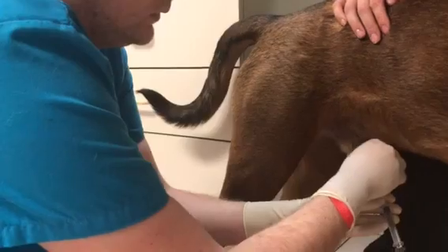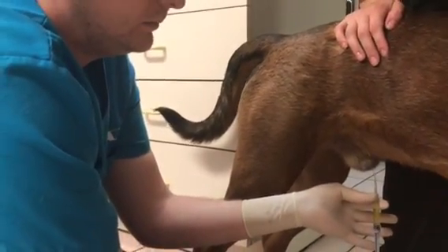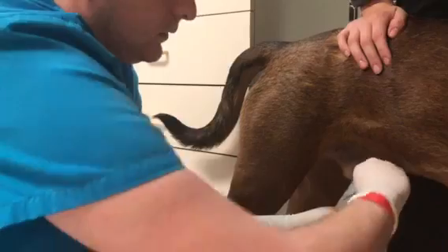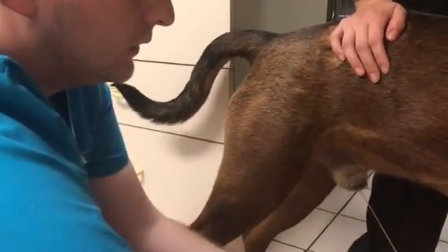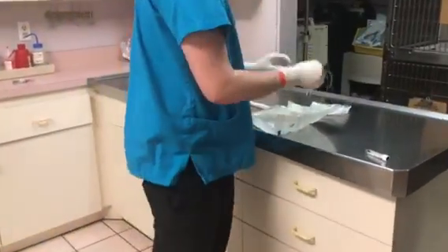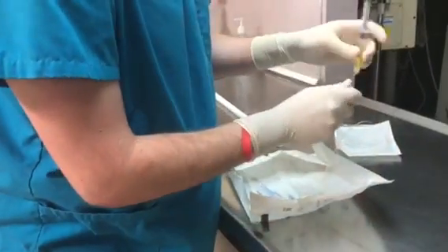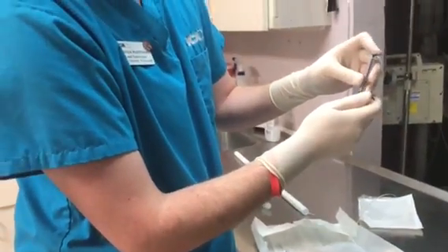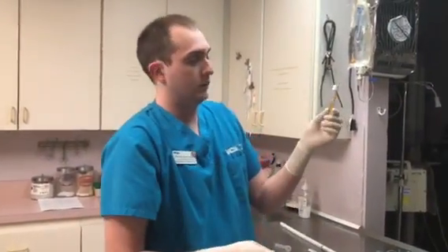Sometimes you just need to advance a little bit more. And then you'll get your urine. Always squeeze the end, and then pull out. Then you can go to your tube right here. And there you go, that's how you get a urinary catheter for male catheterization.